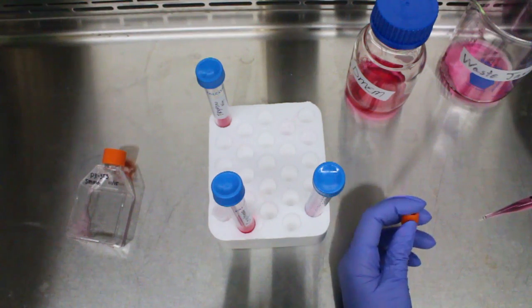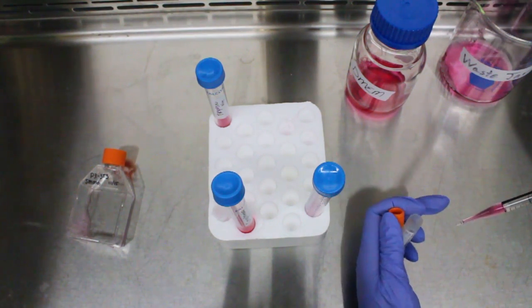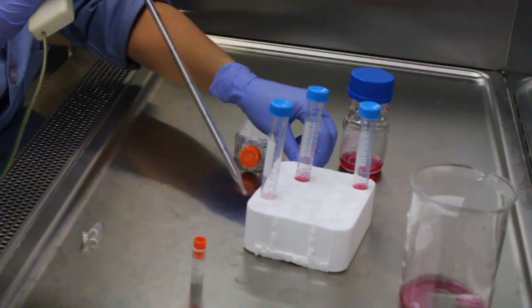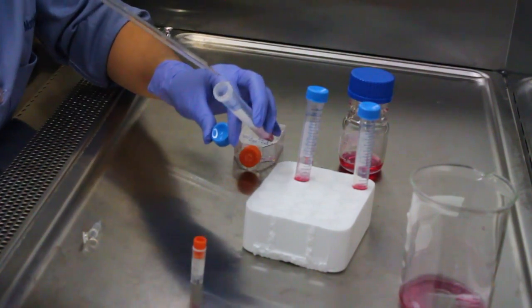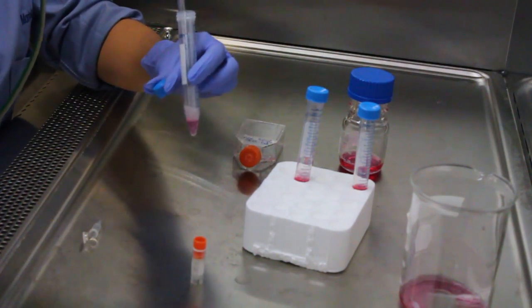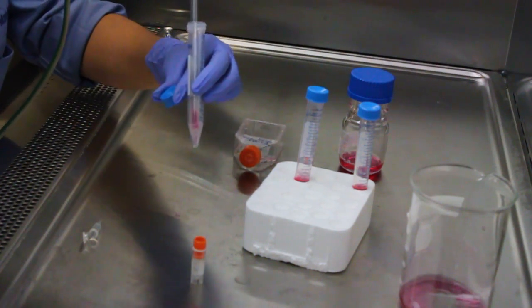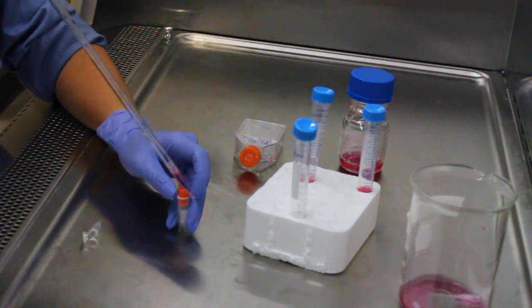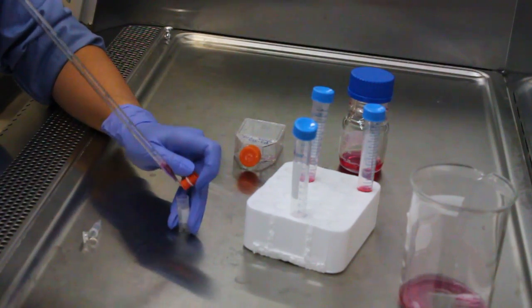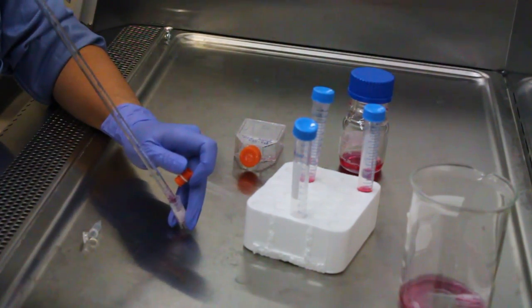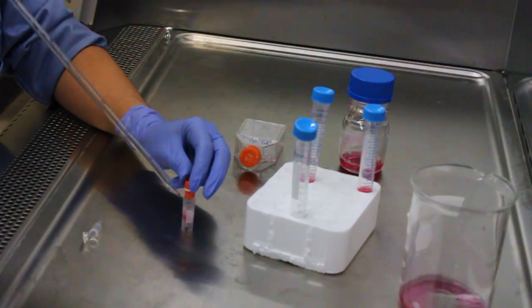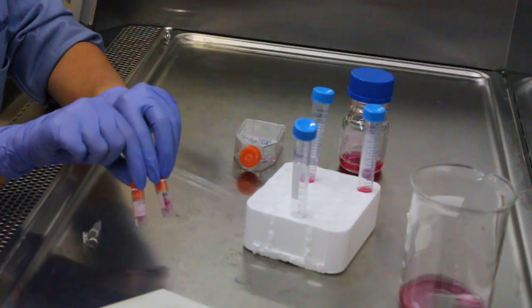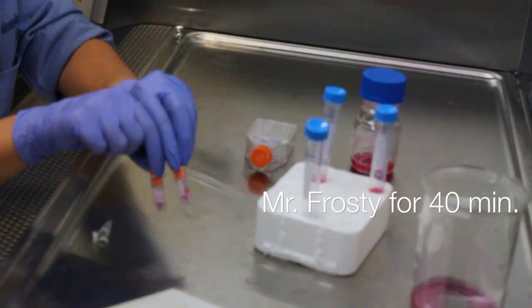Grab 0.5 milliliters of the sample and place it into the first cryo vial. Do the same for the second cryo vial. We are splitting into two cryo vials because the 3T3 cell line proliferates very quickly, and this allows the cells enough space to grow when they are plated next. Now we have our two cryo vials that are ready for freezing, but first place them in Mr. Frosty for 40 minutes.